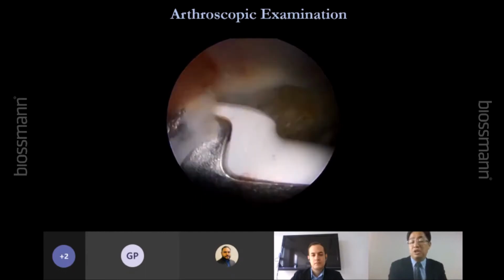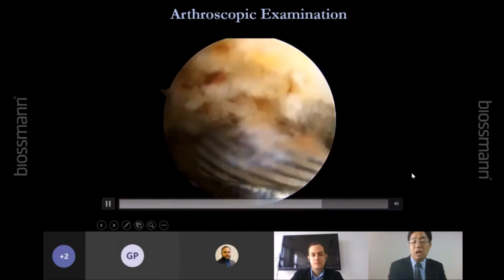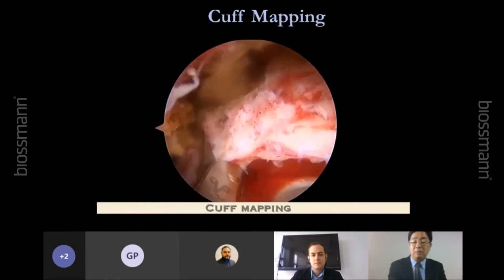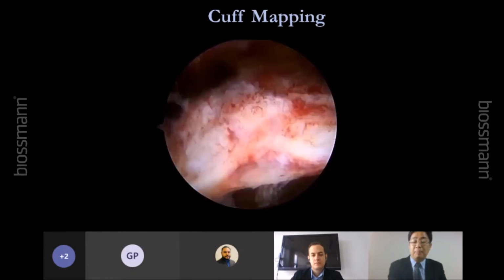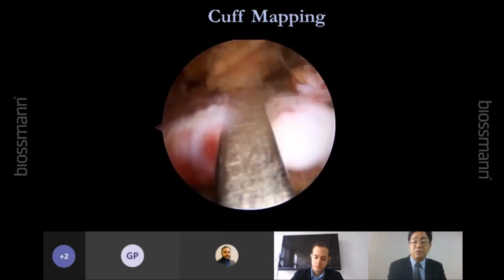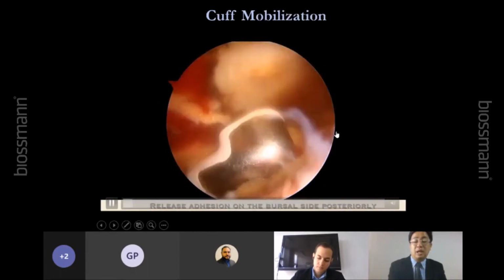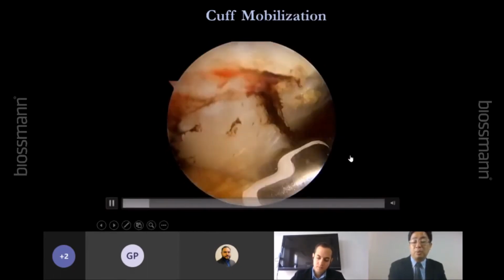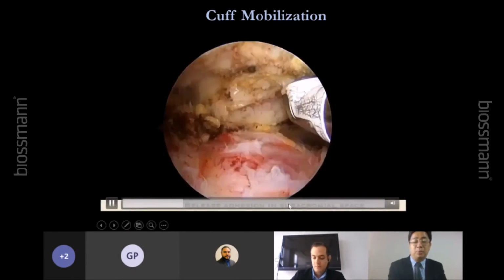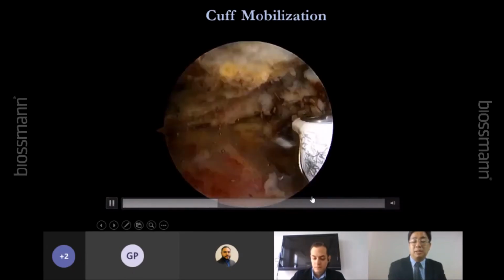We do the biceps tenotomy first, decompression, and then we do the cuff mobilization. This patient, the cuff is quite retracted so far. It's like a Patte 3, okay, and a lot of scar tissue. So this patient, we do the cuff release from the coracoid process. Okay, release the cuff from the roof and also the coracoid process. Okay, after that, okay, we put the anchors. We put 3 anchors on the medial footprint.